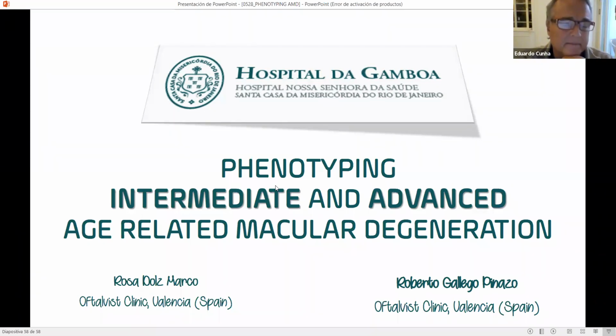And that's a little bit confusing with the hyporeflective wedge that Dr. Querques described. That's why the group in New York proposed the plateau sign, because there are two wedges. One with a wedge shape described by Moniz at the margin, which is hyporeflectivity, and then the plateau that we saw at the beginning.